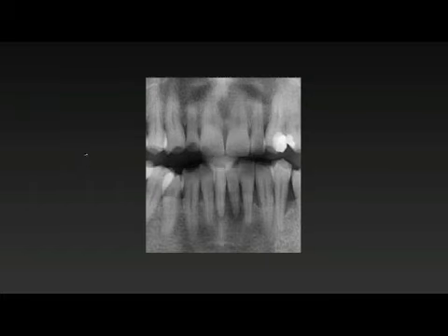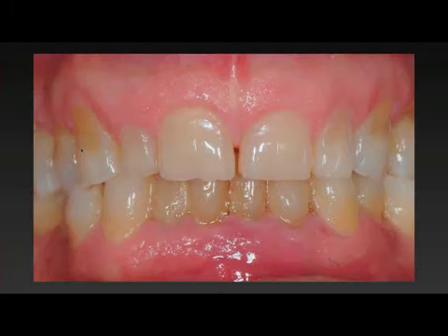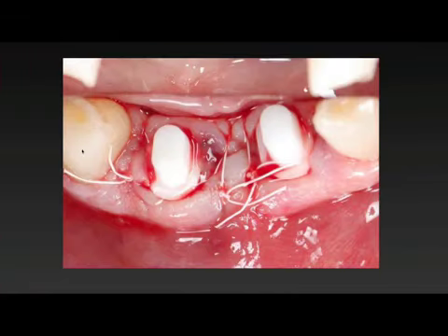This is a case of the replacement of anterior 4 incisors, periodontally involved teeth, which were destined to be extracted. The 4 teeth were removed, and immediate CeraRoot 14s were placed.